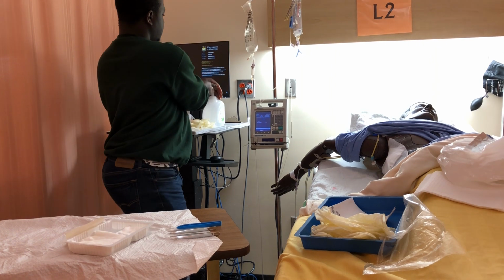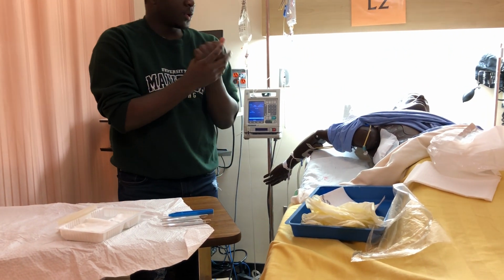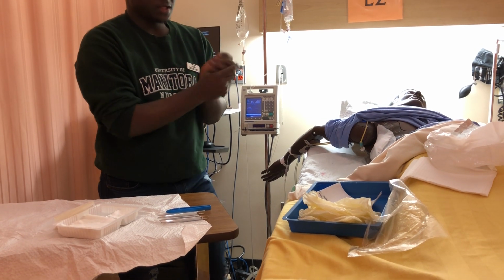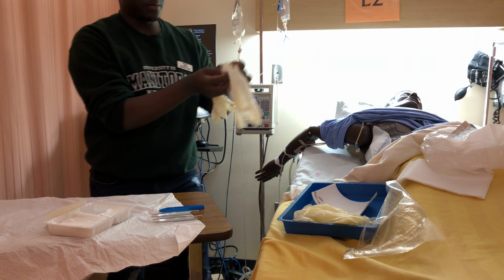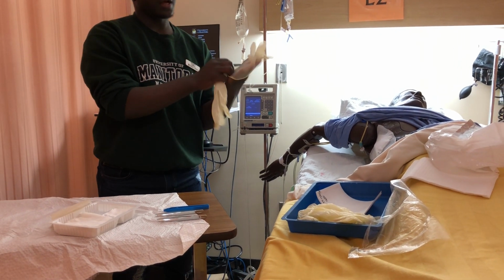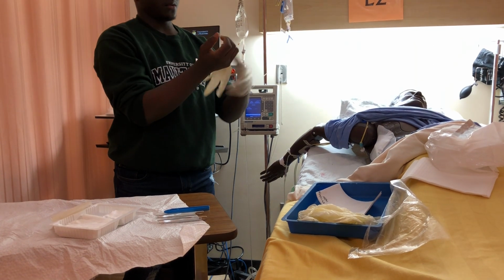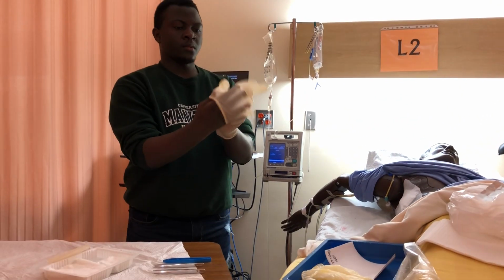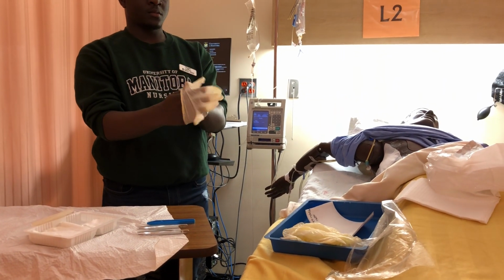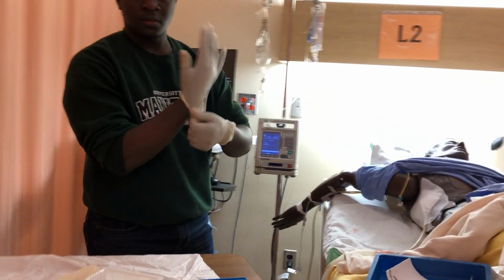So before that I'll just wash my hands again and then put on my gloves. And I'll be doing a non-touch clean technique. So I'll be using clean gloves, but I'll make sure that nothing gets contaminated as I go through my procedure. So now everything is good here. I'm also going to put an O2 monitor on him, so when I'm doing all my tasks I know that he is not desaturating.